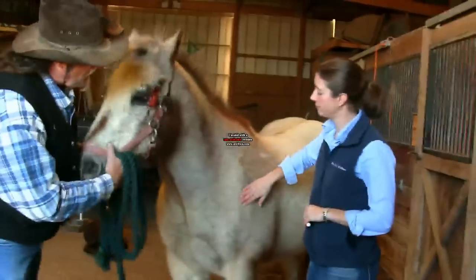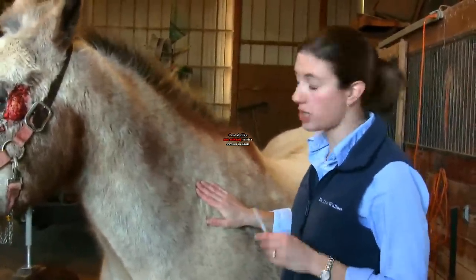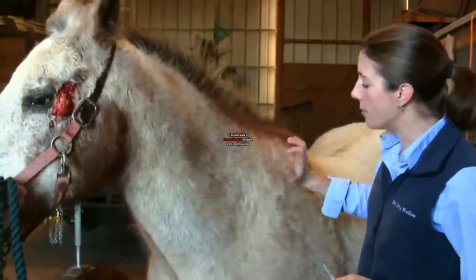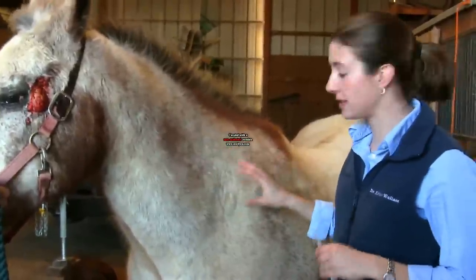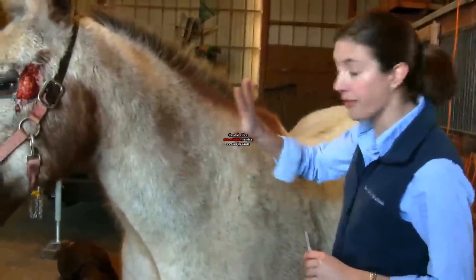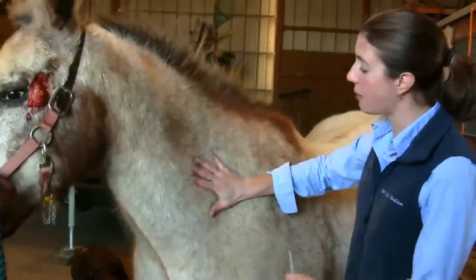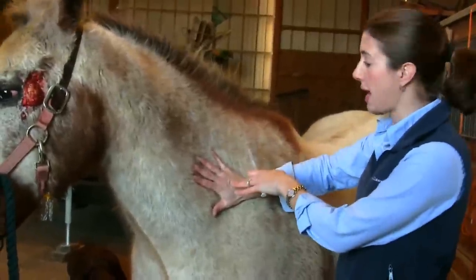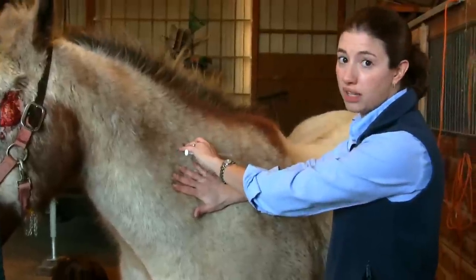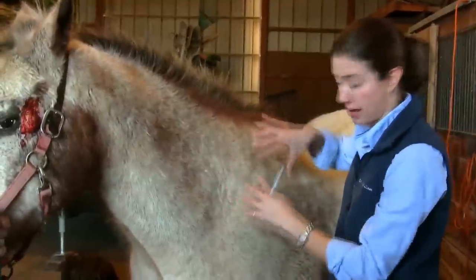Most vaccines and the usual injections — yearly shots, annual vaccines — we want to give in the neck muscle. The best way to find the spot is to find the shoulder blade and put a hand right in front of it, butting the palm up to that shoulder blade, and aim for the palm of your hand. We don't want to go too high because we have the nuchal ligament — it's fibrous tissue, nothing absorbs there, there's no muscle.